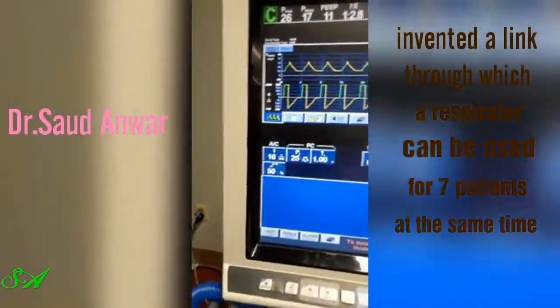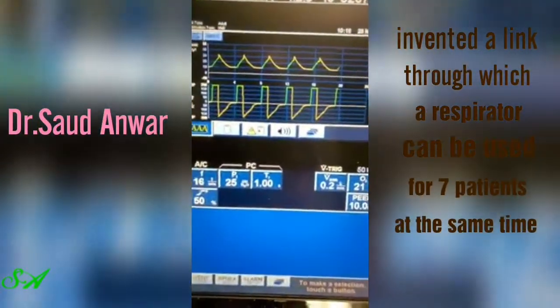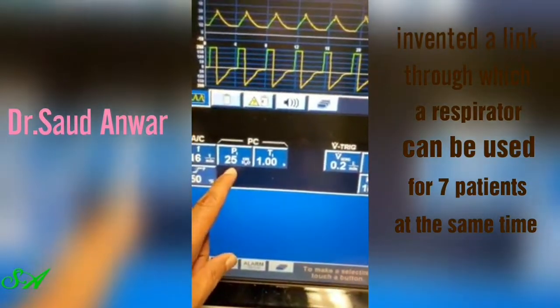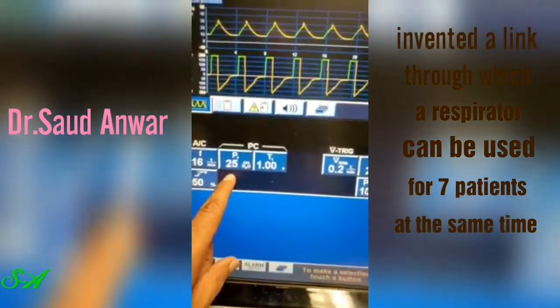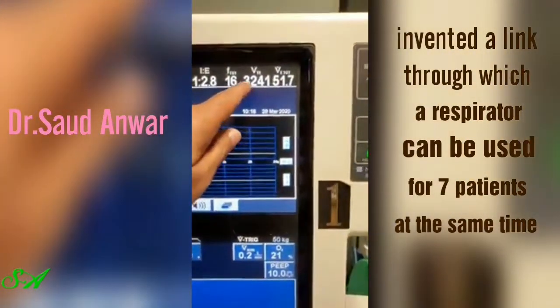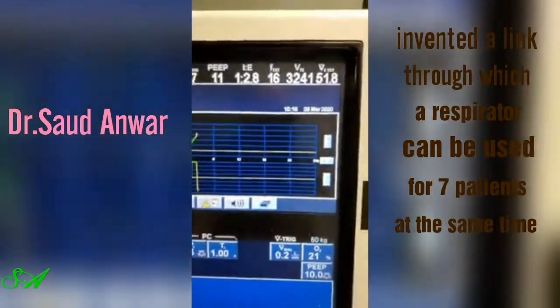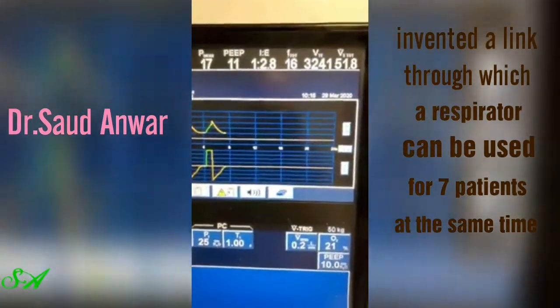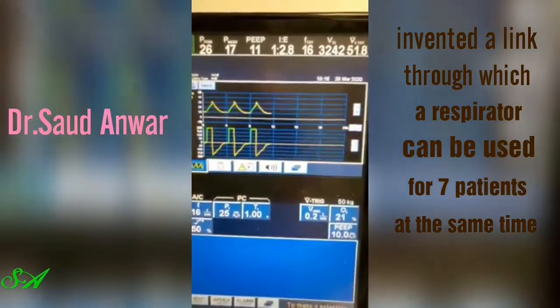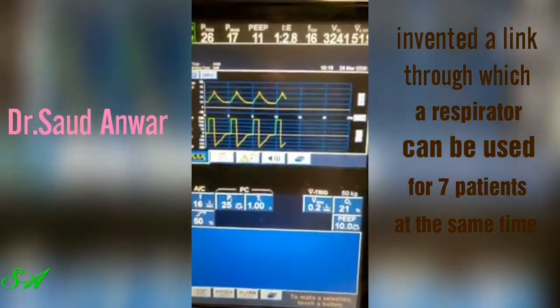And here's the way to do this. This is for the pressure control mode, and we have kept the inspiratory pressure at 25. With the inspiratory pressure of 25, we are getting a tidal volume of 3,241. Now that number scares you, but you have to divide that by 7, and it comes down to 450 something, which is exactly what you would want on these patients.